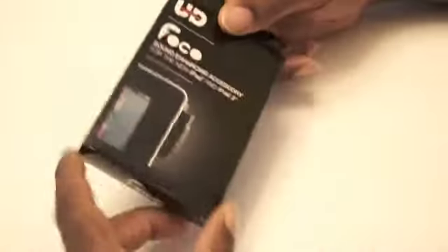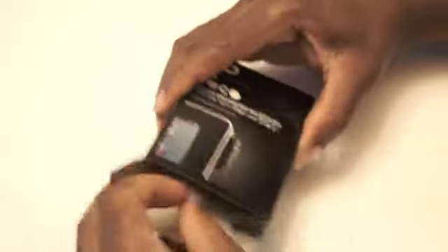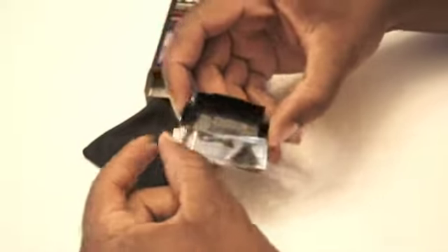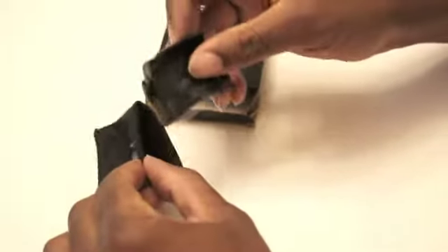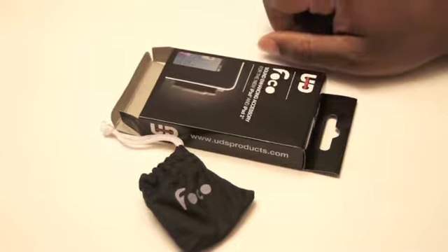When you receive your FOCO, this is the package, and you have the instructions on the back. When you open the box, there will be your FOCO and the carry pouch. The FOCO will come with a protective film, and when you're not using your FOCO, you can easily store it in the pouch. This is what comes in the FOCO pad.